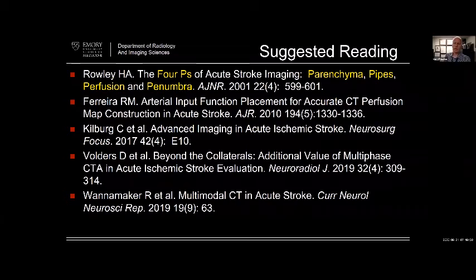So classically, on the head CT, some of the tissue occasionally can have an increased density. And the question is, is it increased protein? That is typical of a different time. So cortical laminar necrosis, or laminar necrosis, is high protein, and that's typical of a different time point in terms of taking care of patients.